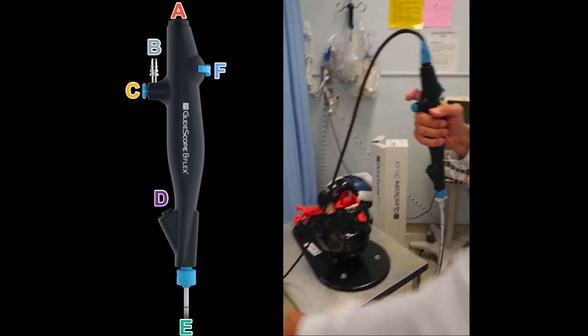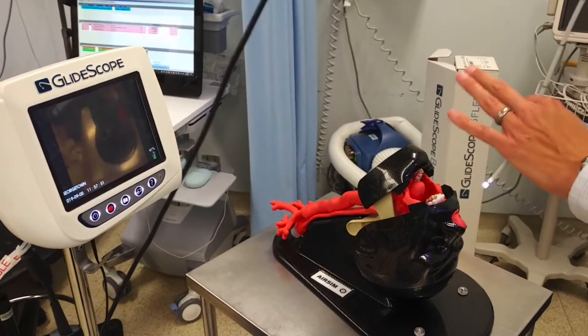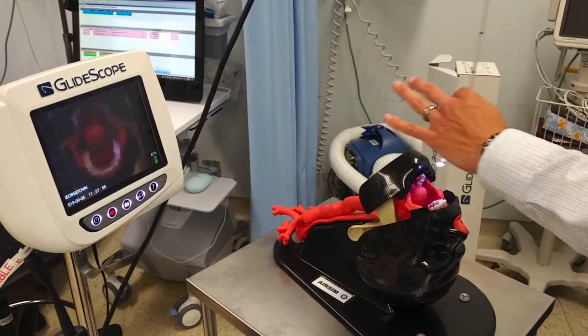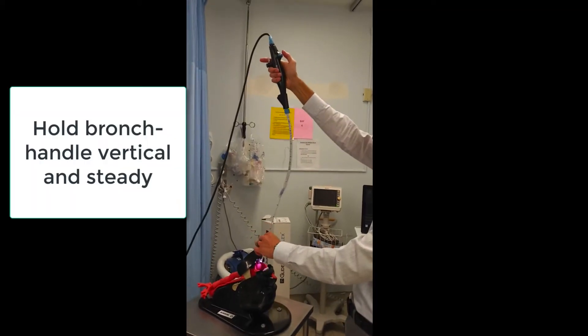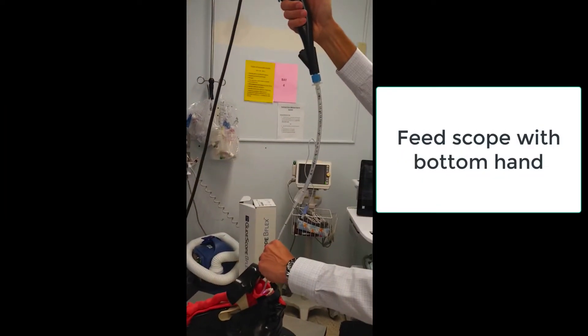Now let's talk about the bronchoscopic procedure. You want to have the instrument straight, on plane, midline, and fully upright. Observe the tip of the instrument and follow the base of the tongue with the midline. Once past the base of the tongue, look at the monitor.